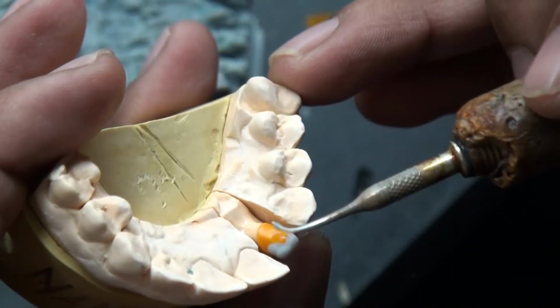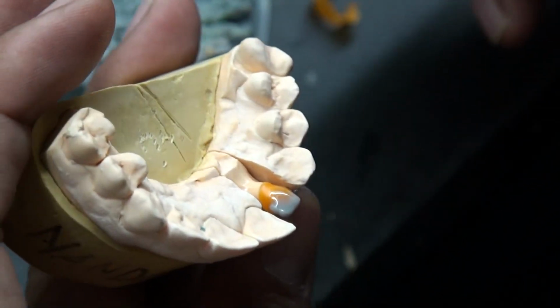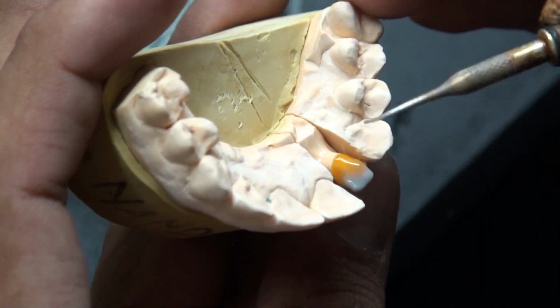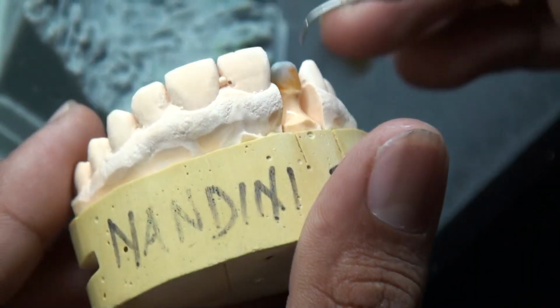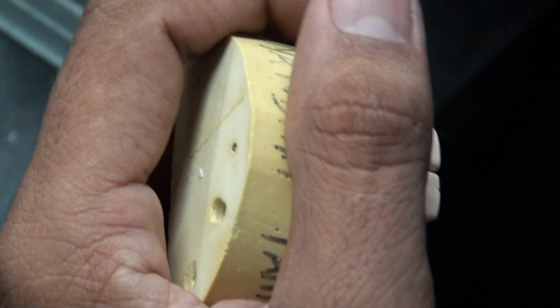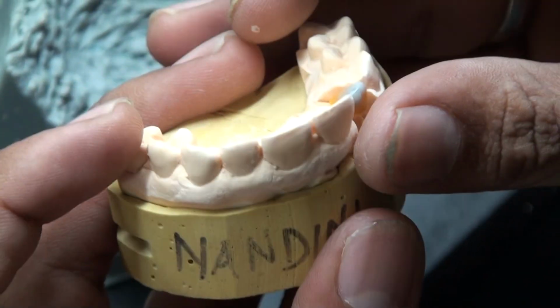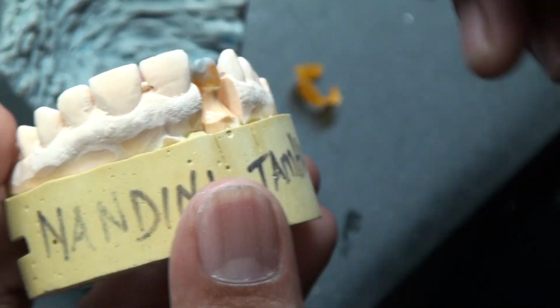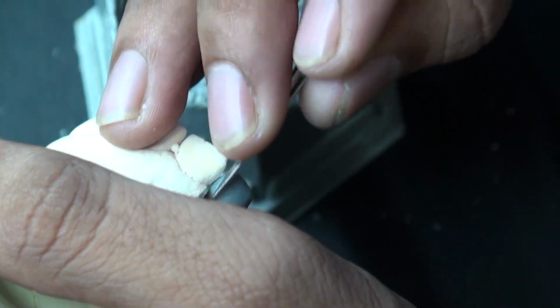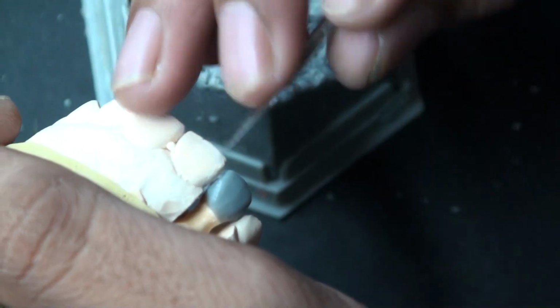If you've got the time, I highly recommend this process. Buy yourself a waxing machine and get some nice little wax. You can do your own wax up, but that's how the lab technicians do it. They're obviously very, very skilled at doing this. As you can see, it takes a lot of time and a lot of skill to get a good wax pattern. Now that's the wax pattern that's been finished, and he's just using a little carver.